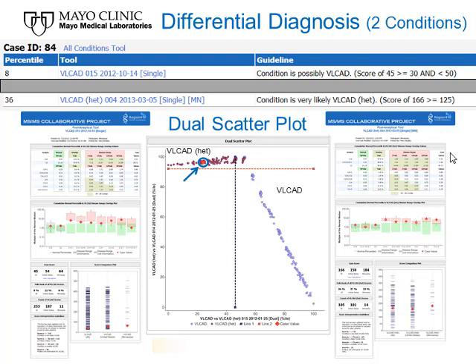In summary, the post-analytical interpretation of the results of a 96-well plate, 91 patients, can be finalized in less than 1 minute of work by a user trained to navigate the R4S website and the tools therein. The process is rapid, paperless, and most importantly, it provides a mechanism to maintain consistency among different users who may have vastly different expertise, from just a few months to years, if not decades, of experience.